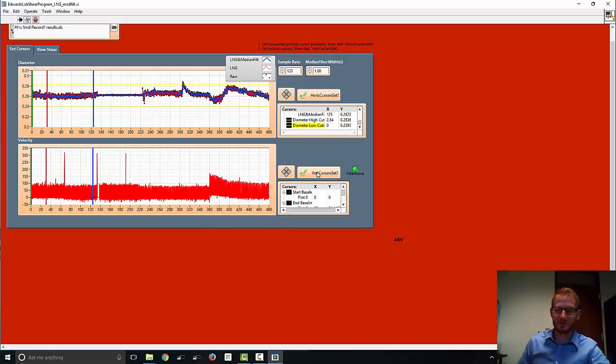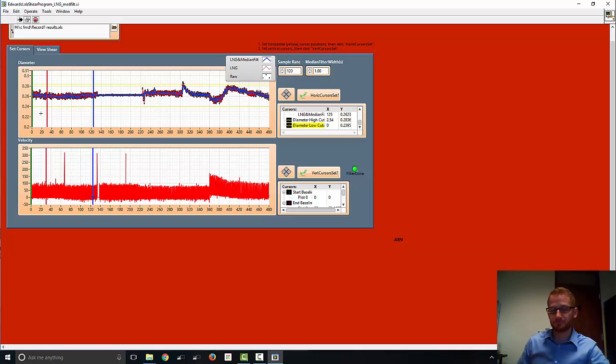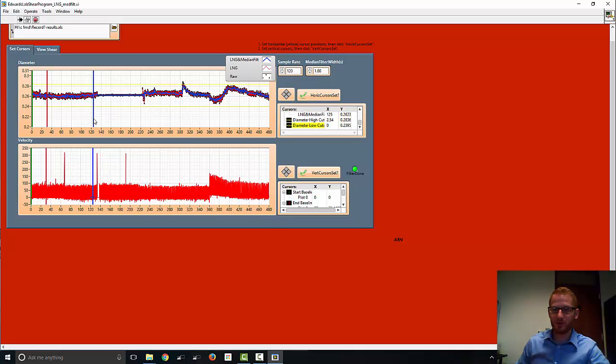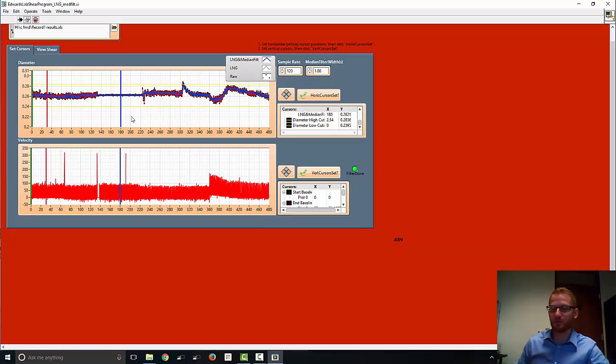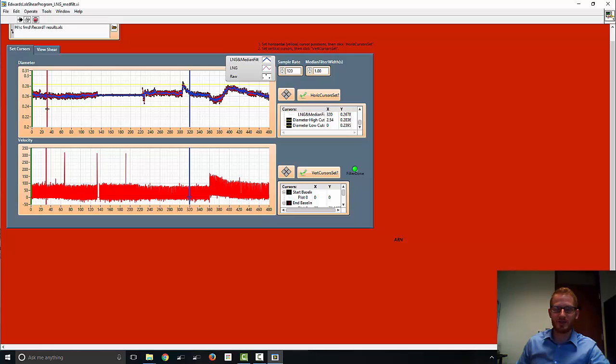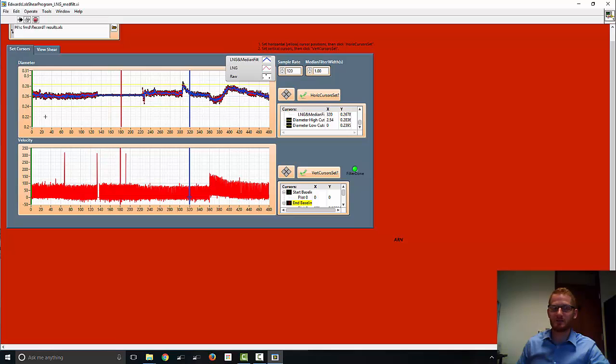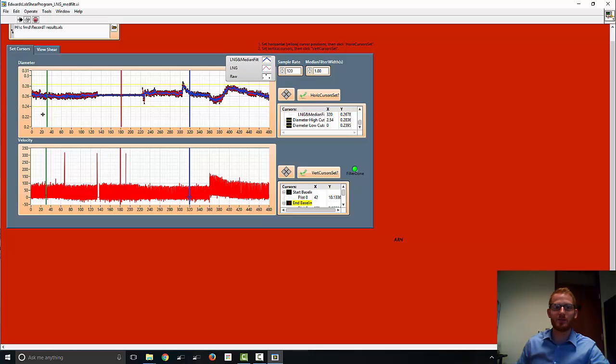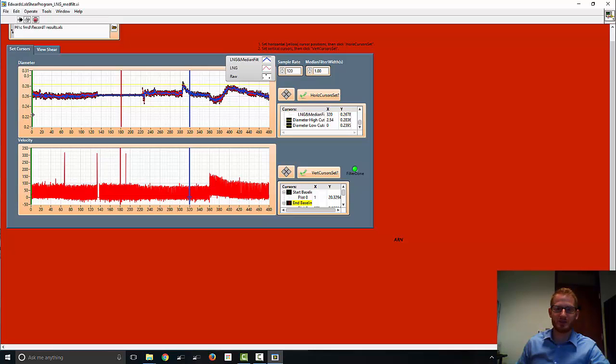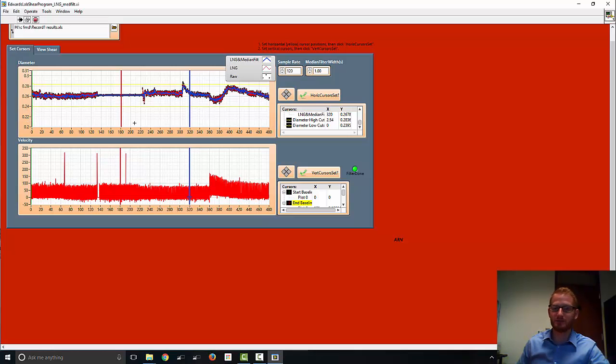So now we need to set the vertical cursors, which we're going to have another button to set those in a second, but we need to put them where we want them to be. Alright, so we have three vertical cursors. So we had these two yellow ones that we are setting by dragging. We can also drag the vertical ones, which I'm doing right now. You can see me dragging the blue line. And you want to be dragging using this top diameter box. If you try to do it with the bottom box, it doesn't like that. It just won't move. So you want to drag these using the top box. So there's a green bar, a red bar, and a blue bar. The green bar goes at the beginning of your baseline. So anything before that is going to be excluded. So I want all of it for this video. There's nothing at the beginning you need to exclude. So I'm dragging it all the way to zero.